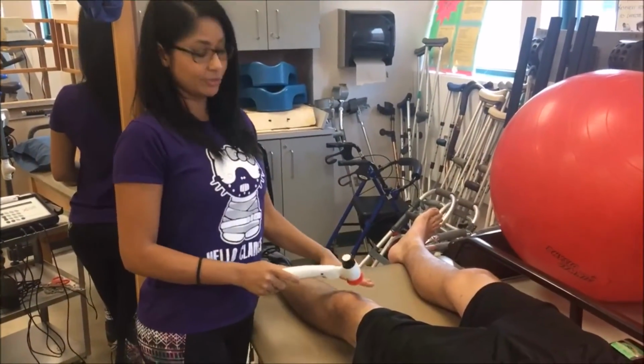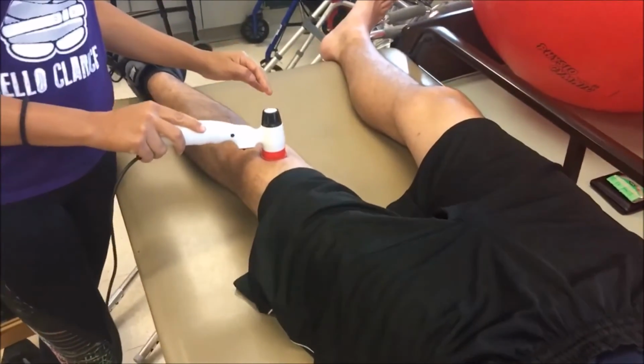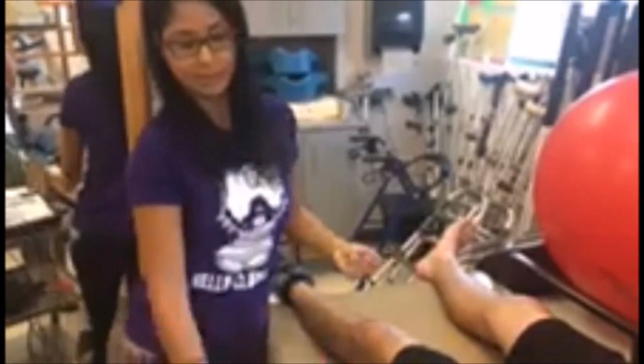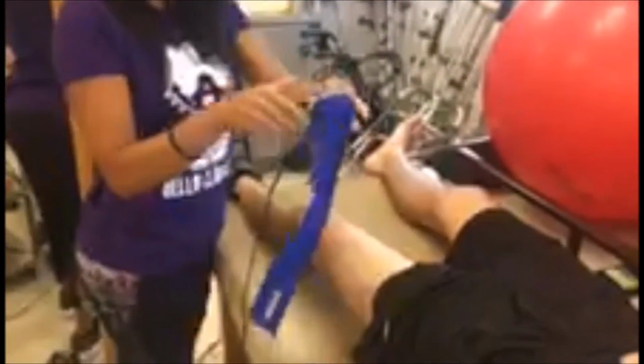To treat pain or osteoarthritis of the knee, we would surround the knee area with the laser to treat the pain. For other conditions such as patellar tendonitis, we can place 2 SLDs on the quadriceps. One higher in the quad, and one on the lower area in the quad. And then we can place the laser on the patellar tendon.